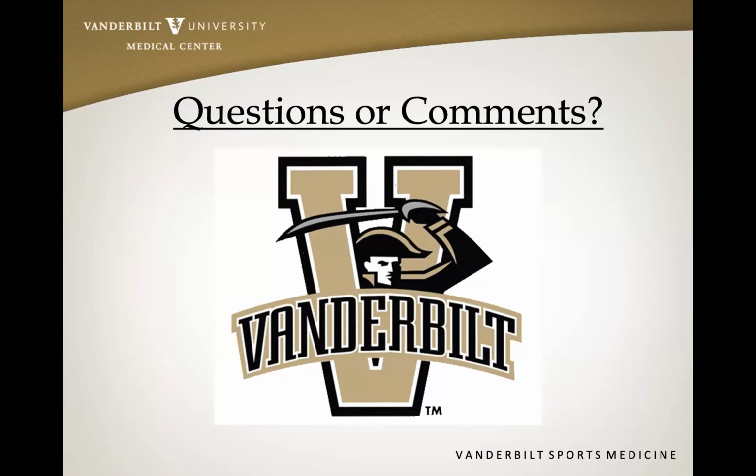Sometimes you'll get someone coming in with a 0.7 Tesla MRI that is kind of grainy and looks a little bit like a CT scan, and you really rely on active edema and T2 to demonstrate some pathology, and sometimes you'll get someone with a really nice 3T scan and everything's pretty clear. And that's the same with ultrasound, right? There's different resolution of ultrasound machines, and so you definitely have to take the technical limitations of a study into account when you're looking at it.